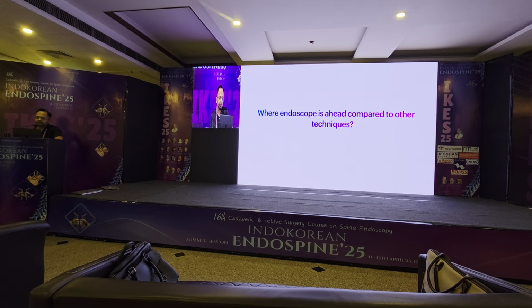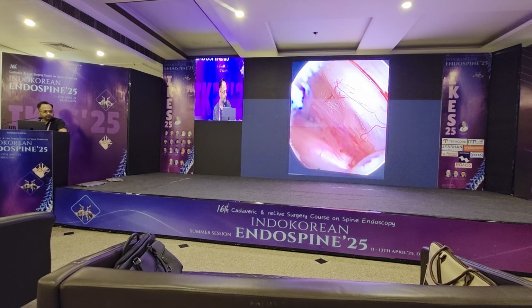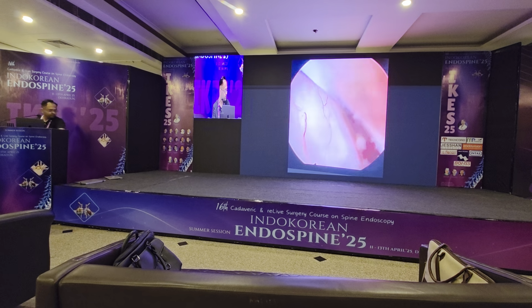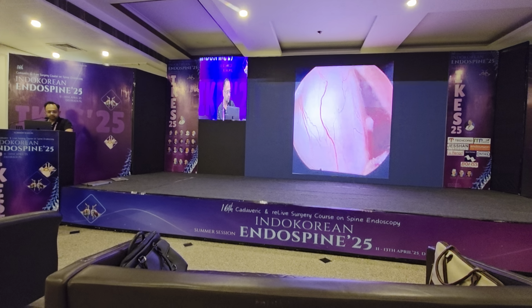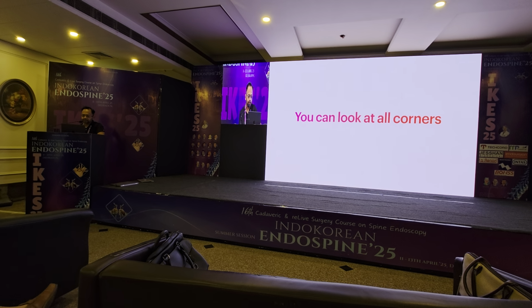So why is endoscopy ahead compared to other techniques? Because it has better visualization. You can look into all the corners where sometimes it's difficult using a microscope.